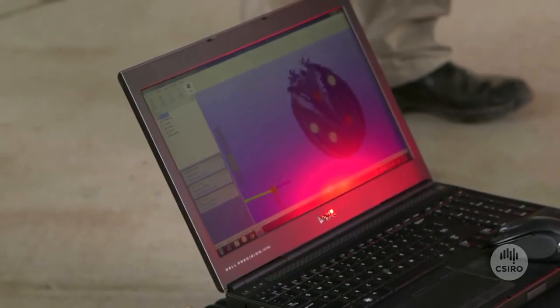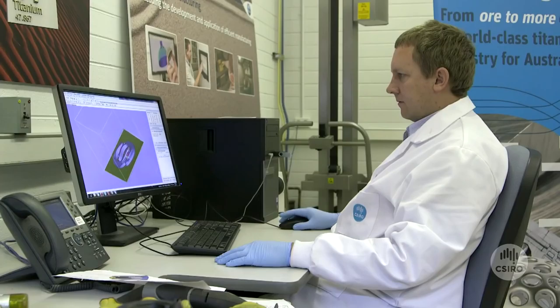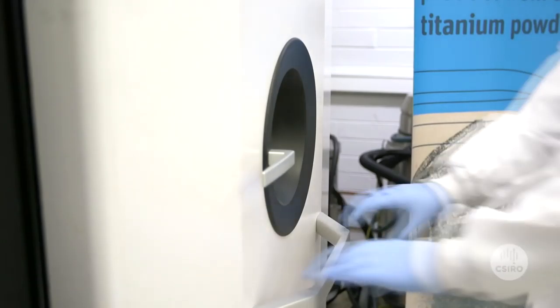We took that information from the 3D scanner and from the x-rays back to the CSIRO lab and we designed the shoe specifically for the horse.